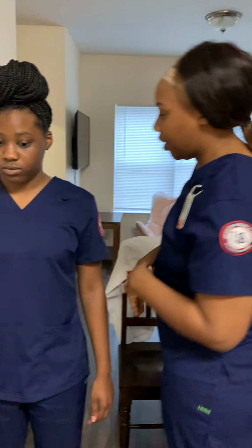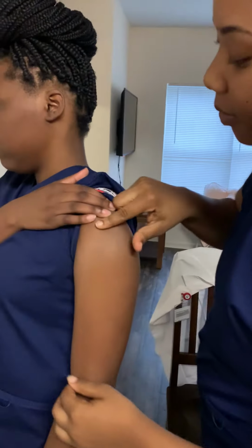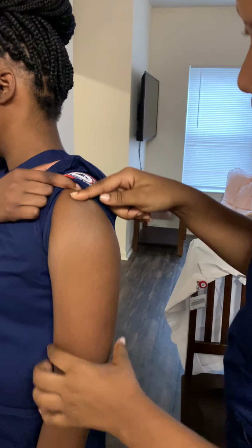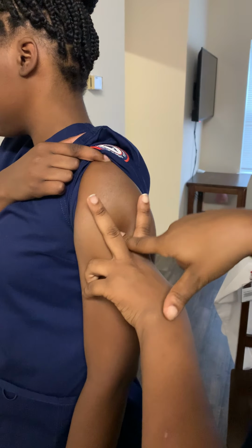If I was doing an intramuscular injection, I would locate either the deltoid muscle here. I have the acromion process, and then I will locate 3 fingers down and place my V here, and I will insert it here.